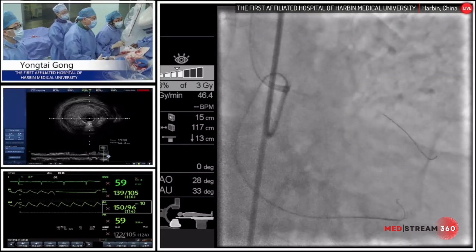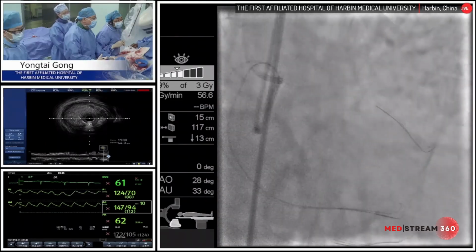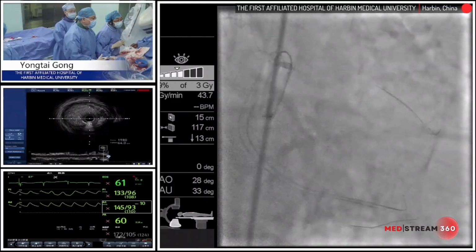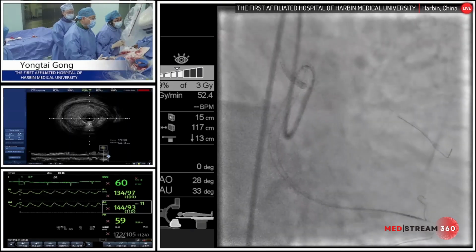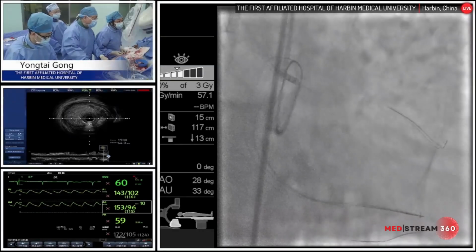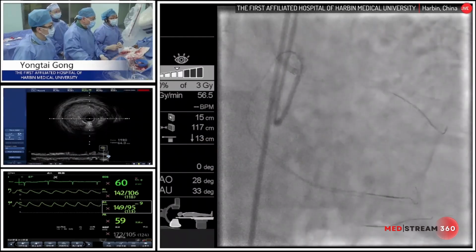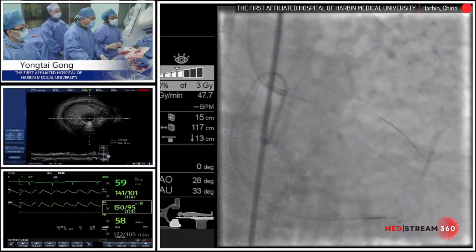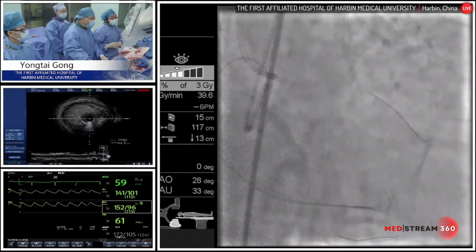I think that for this patient, the toughest spot is that this is, as we just emphasized, a blunt tip, totally occluded LAD with no clear entry point from the antegrade. It goes up to the bifurcation site. And also the insertion of a guide wire into the side branch, which is difficult, can act as a marker for the side branch origin.